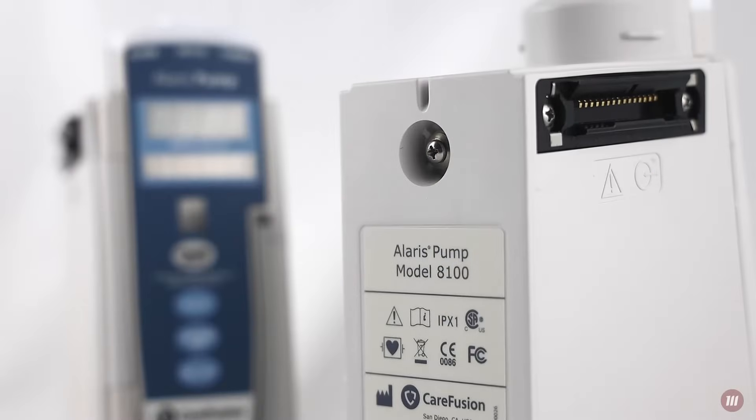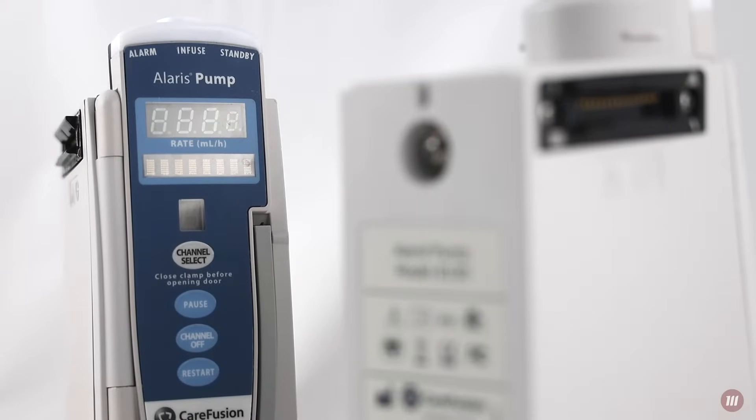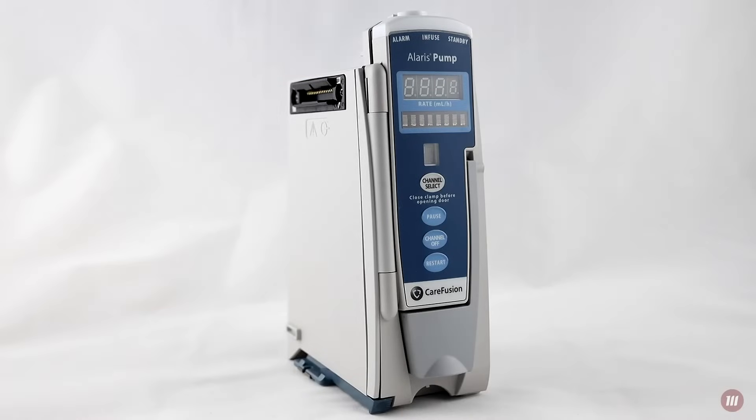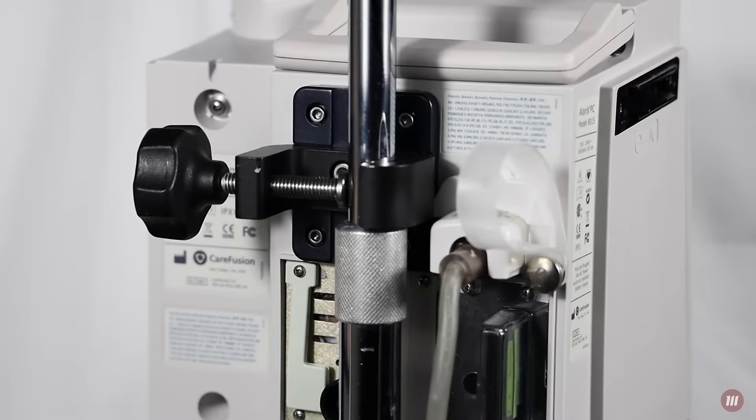The 8100 module is also called the LVP or large volume pump module. It can be mounted to an IV pole with the adjustable clamp found on the back of the point-of-care unit.